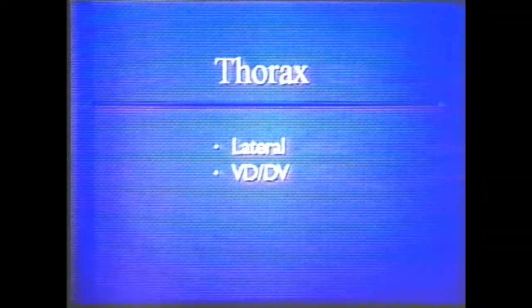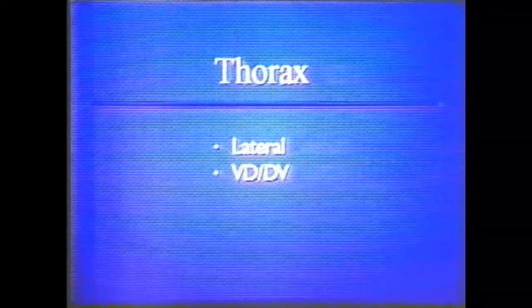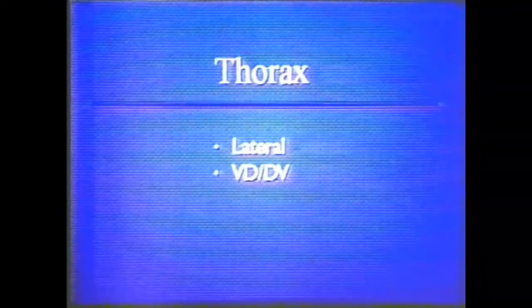With the VD-DV controversy or position, again, it's partly personal choice which you would prefer to do. Some individuals argue that the heart is closer with a DV view, therefore a more accurate image of the heart is obtained.